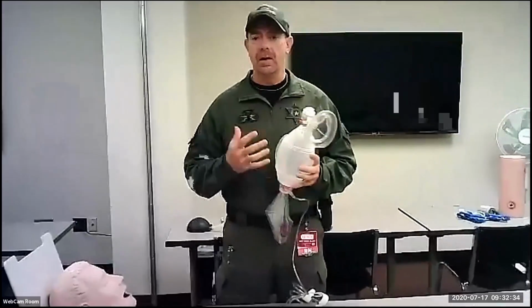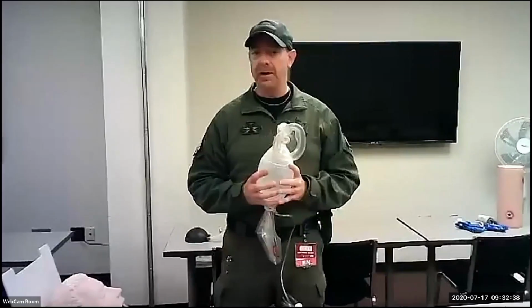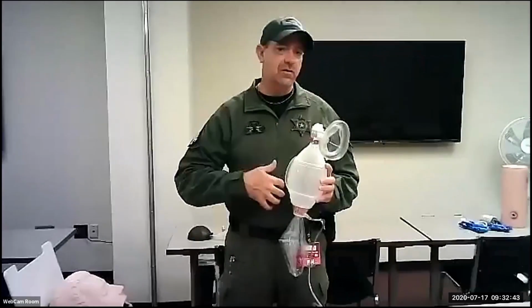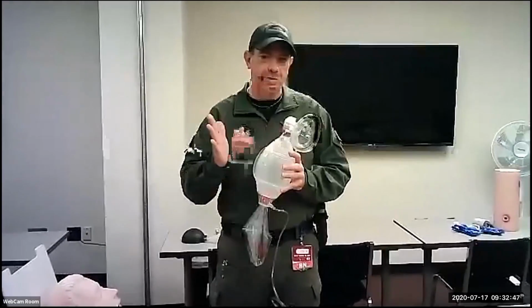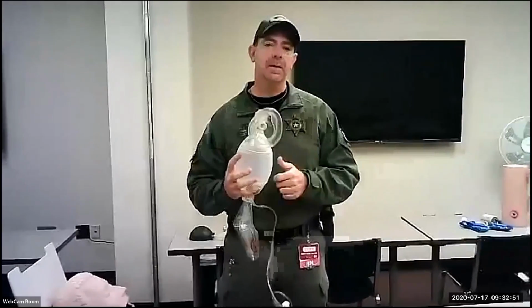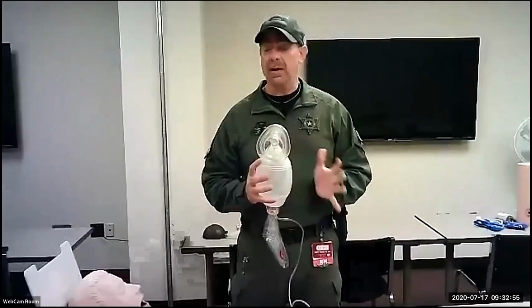What is denitrogenating? Basically 70% of the air that we breathe is nitrogen. Roughly 20 to 21% is oxygen. We're replacing all that extra air in our airway with 100% oxygen. I'm pushing that nitrogen out and replacing it with 100% oxygen. That gives me the ability to take a little bit longer to intubate. Maybe it's not going to be an easy intubation.